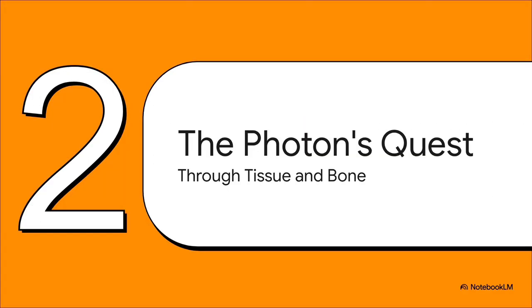So, out of that violent, super hot collision, kinetic energy from an electron gets transformed into something totally new. A brand new particle is born. This is our hero, our protagonist, the X-ray photon. And now its journey is just getting started.